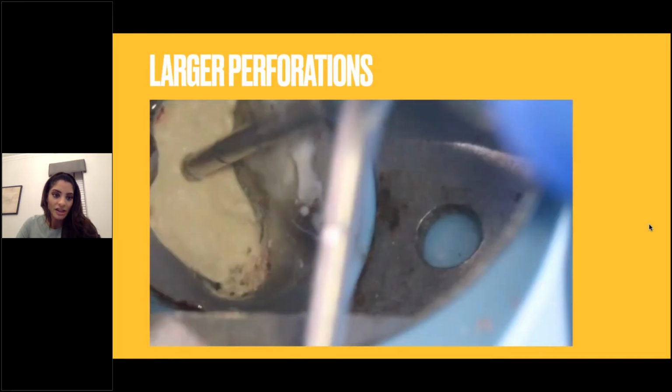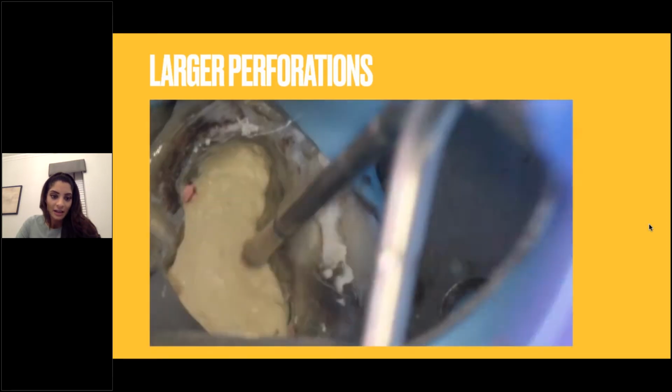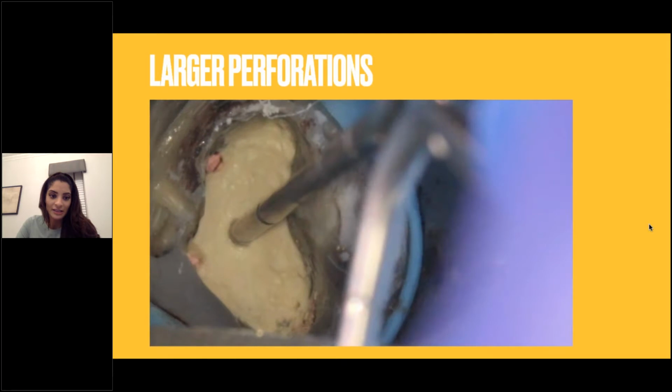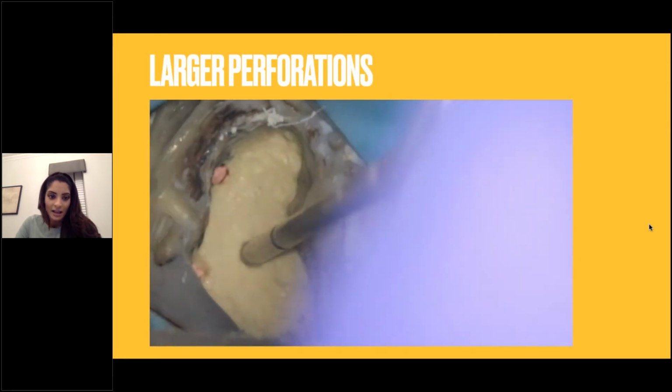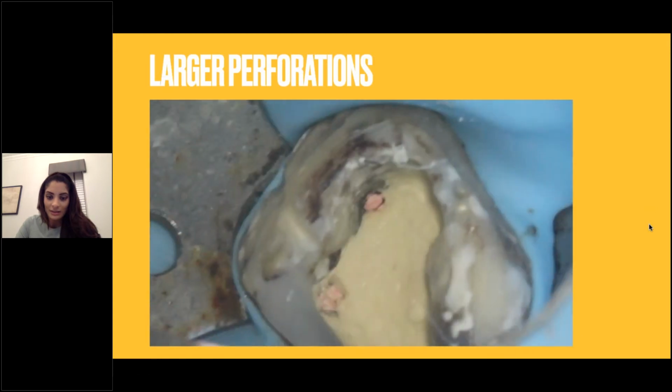And I'm having a gentle feel. Again, the resistance, the seal of this takes a little while to develop, so I'm very gently testing it here. And once this had happened, I then repeated the root canal. And again, I finished this case in one visit.